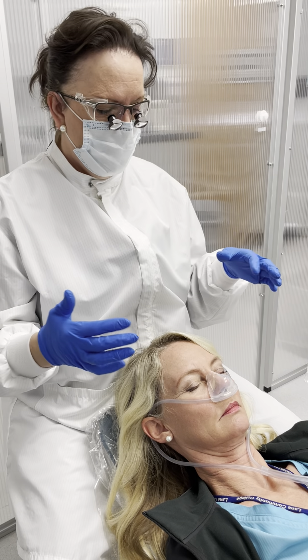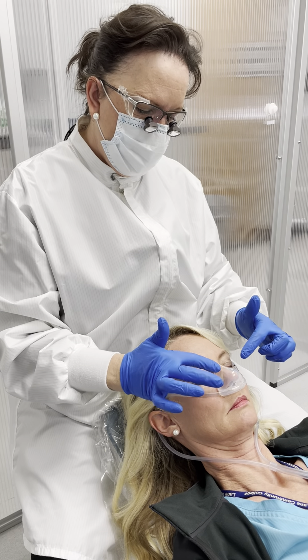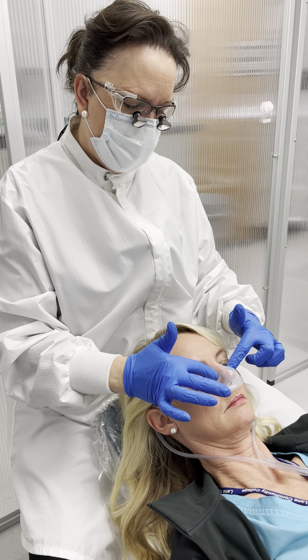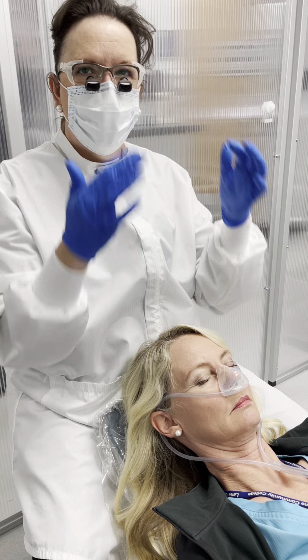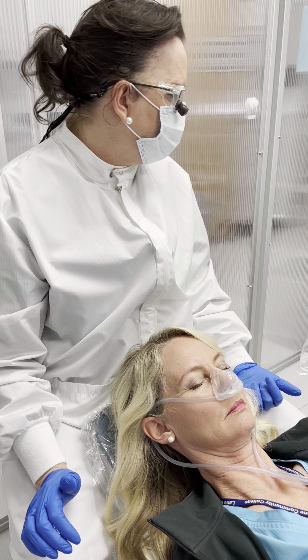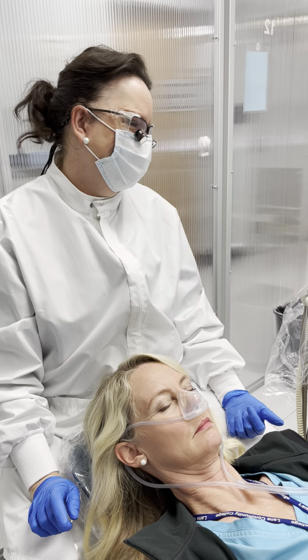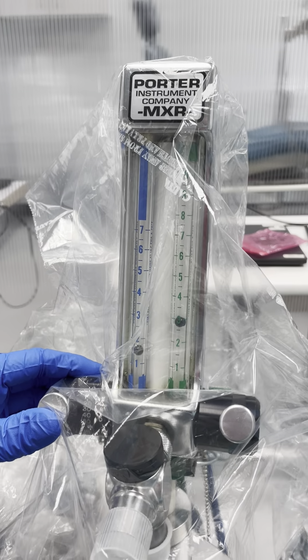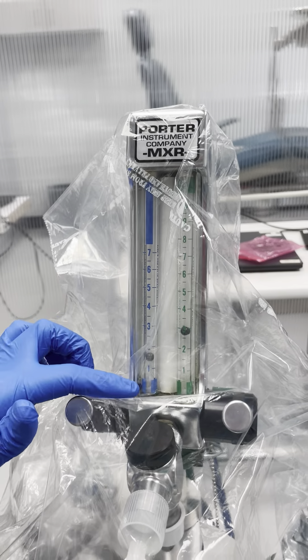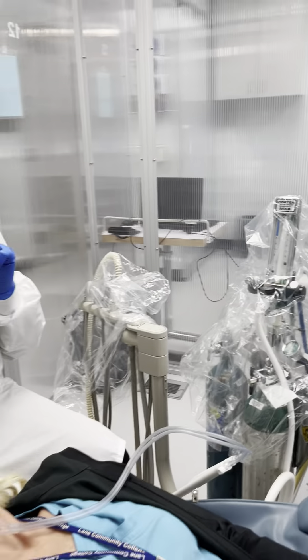If the mask is excessively too big, the patient will blow out gas. The seal here is designed to prevent drying out their eyes. If the patient has glasses, put those over the top — it helps pull the nasal mask down a little too. Ask the patient how they're feeling and increase by a half liter. Now she's at one and a half liters of nitrous and three liters of oxygen — four and a half total liters of gas — and you need to keep track of that as well.